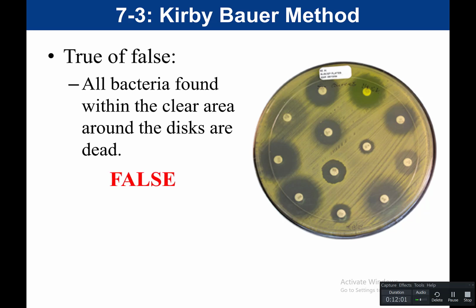And the answer is false. It does not necessarily mean that the bacteria is dead. Remember, zone of inhibition. All we can say by looking at this plate is that the bacteria's growth was inhibited. It's not a kill zone, it's a zone of inhibition. The bacteria's growth is inhibited. And so let's talk about some reasons why they might not be dead. There's actually a couple of reasons.